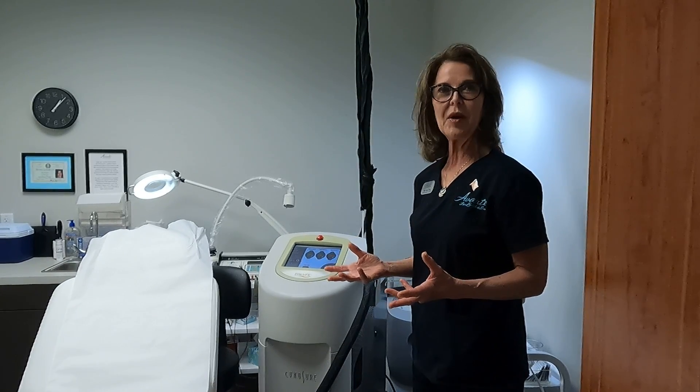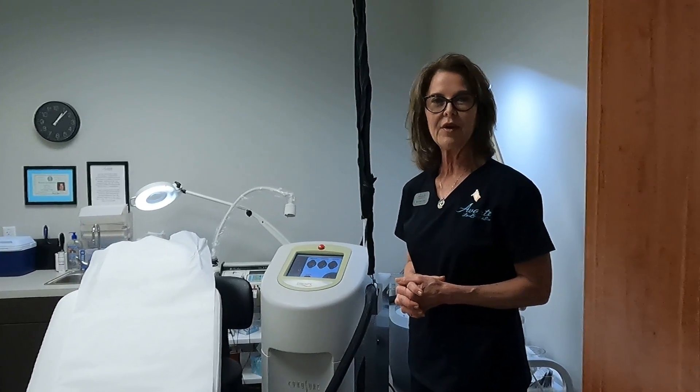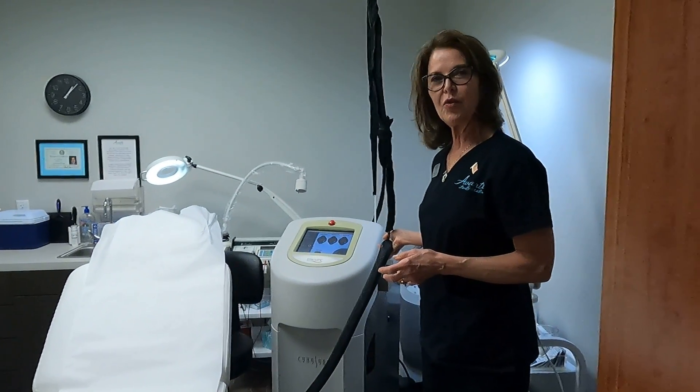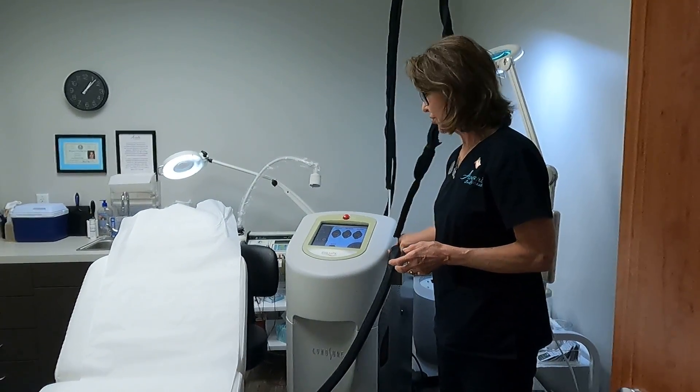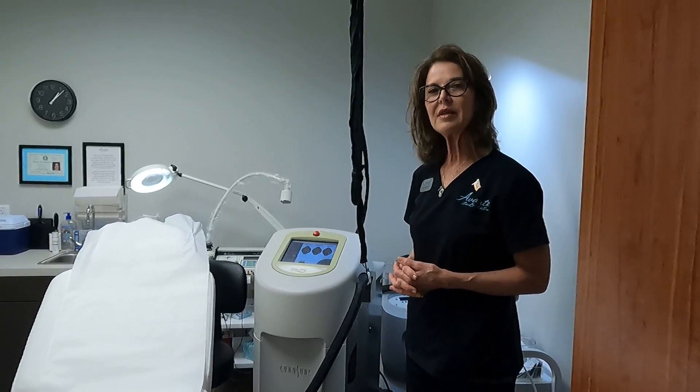Overall, clients tolerate both modalities very well with either method of cooling — the cryogen or the cold air. The cold air tube is attached to the handpiece, so we control it that way, ensuring there's no risk of the client pulling the cooling device away from the skin.